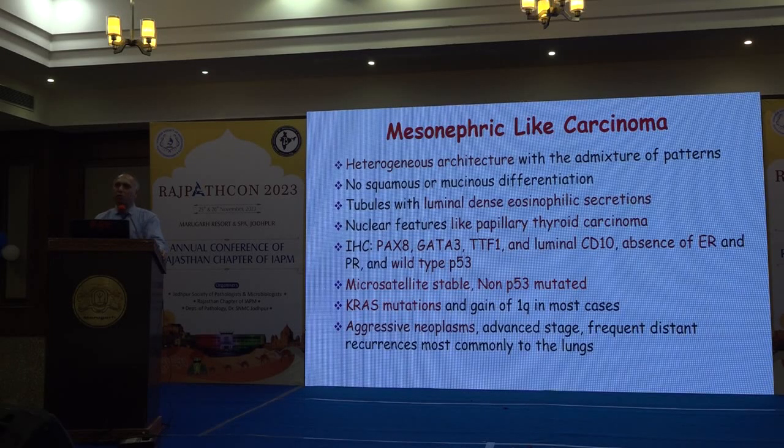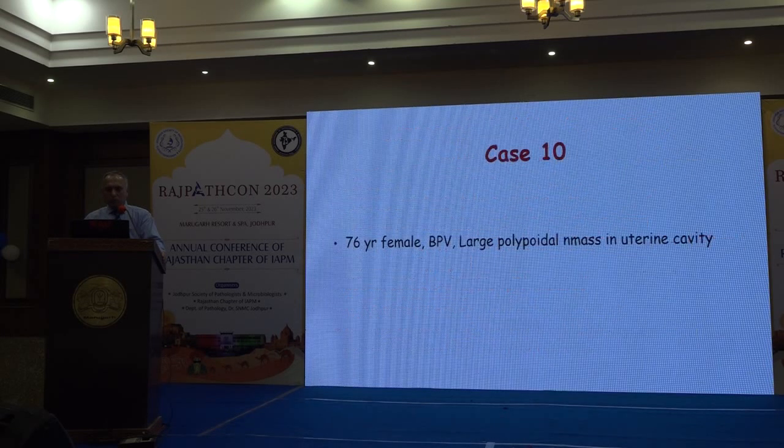This is important to recognize because it is associated with aggressive behavior. And these are the markers which will be positive: PAX8, GATA3, TTF1, luminal CD10. So they are deeply infiltrating tumors and have propensity for metastasis as well.